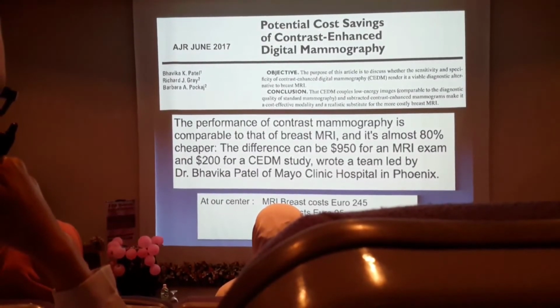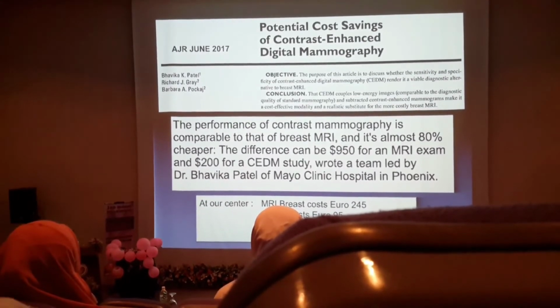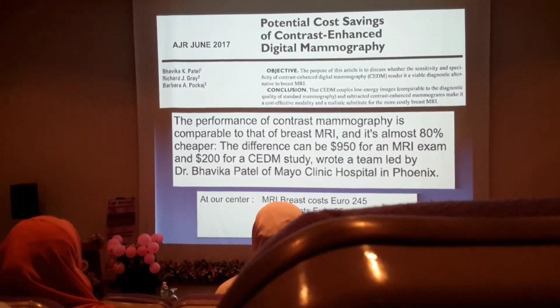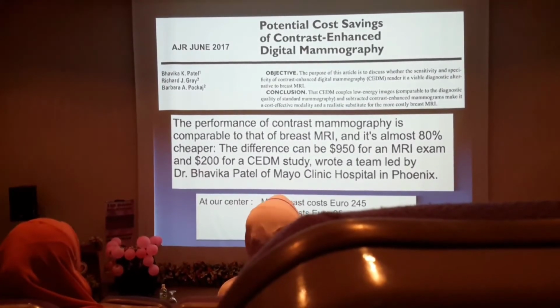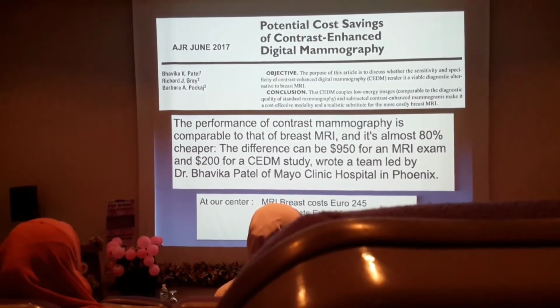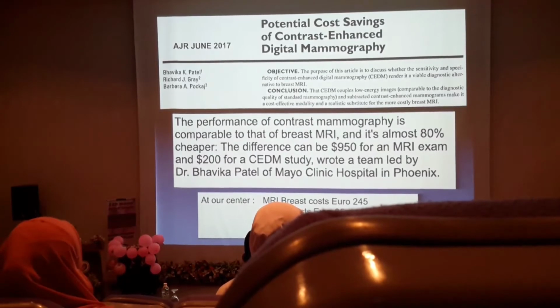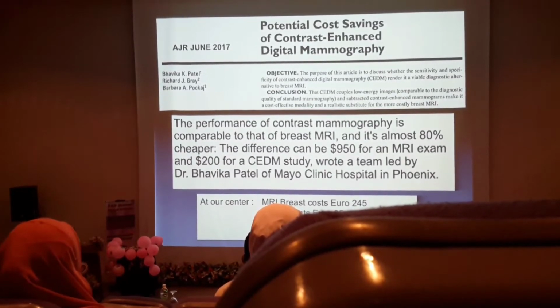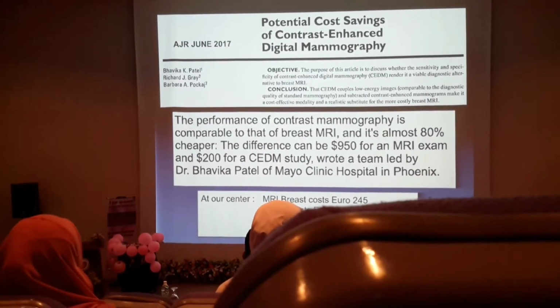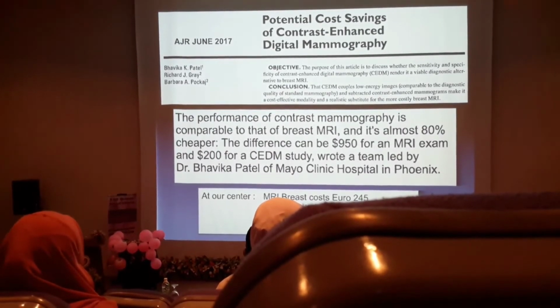I've put up this slide because it was done by Mayo Clinic in June last year. It's about the cost, how much we save, because basically contrasted mammogram is giving us the same information as an MRI. They are both functional imaging. So in the study that was done in Arizona, Mayo Clinic, Arizona, they said that there was an 80% reduction in the cost when we did contrasted mammogram in comparison to MRI.